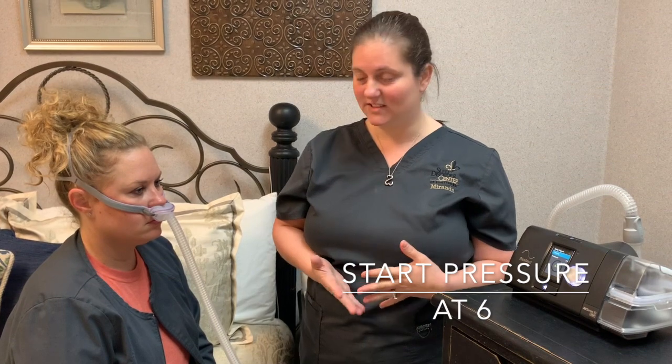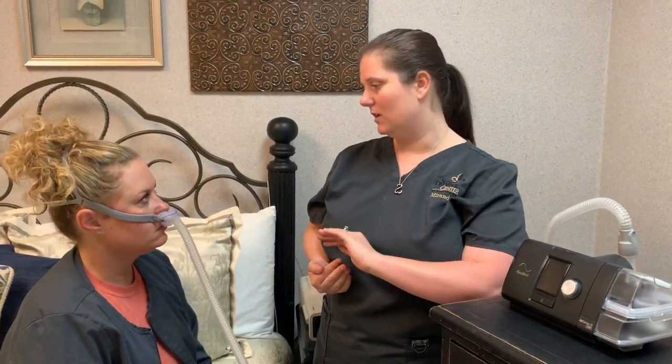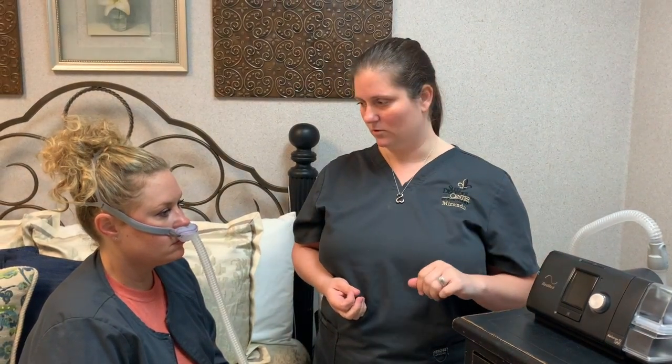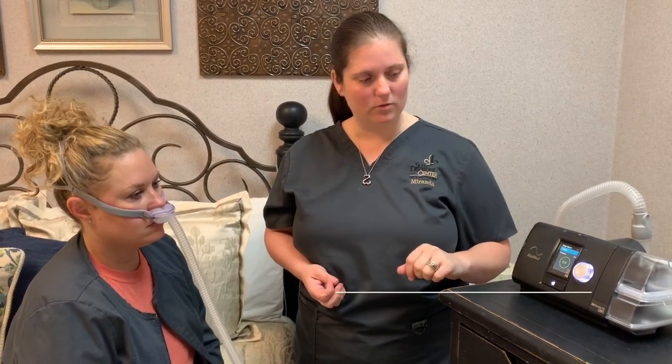Just breathe in — there you go. The machine is on now. It's going to start you out at a pressure of six, and once you get to sleep it's going to auto-titrate you up. It's set from six to sixteen, which means you start on a low pressure of six and it can go all the way to sixteen, but only if you need that. The screen blacks out quickly, so if light bothers you, that goes away.